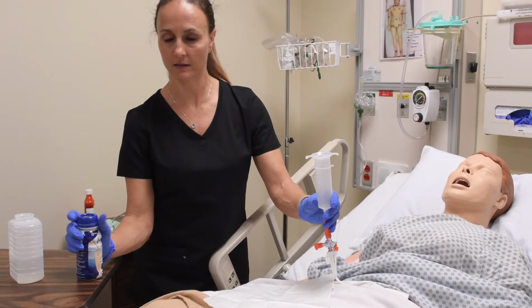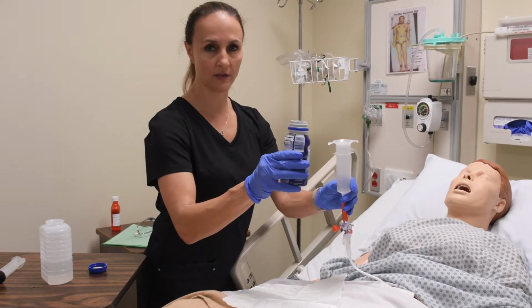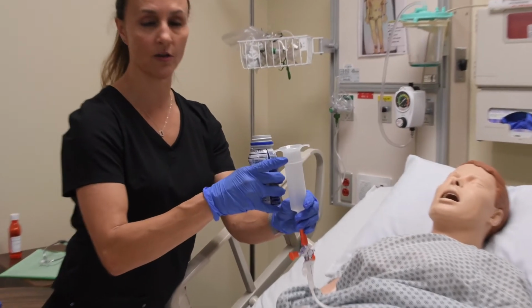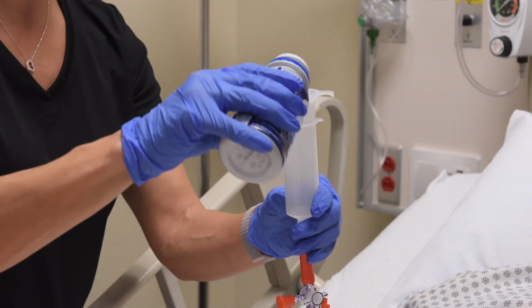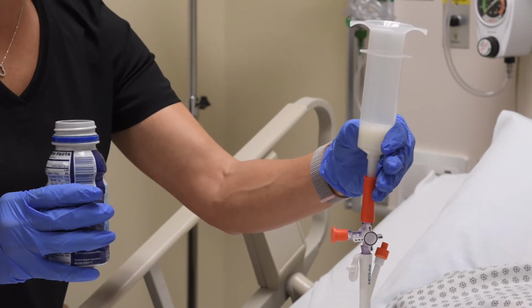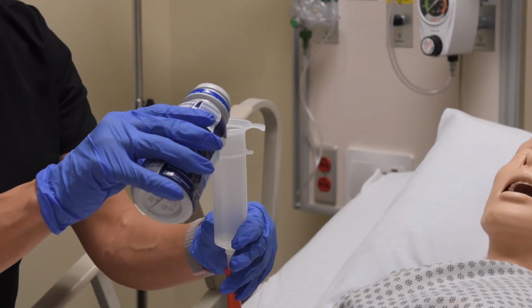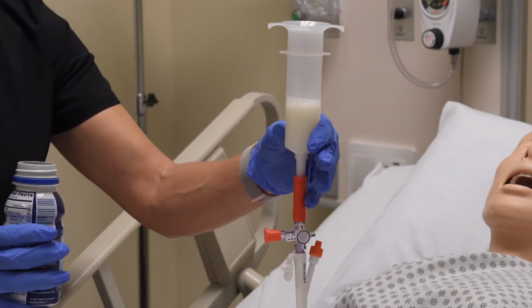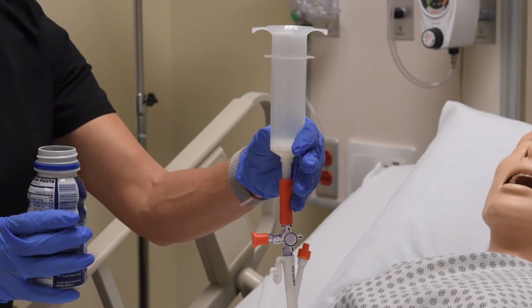I already have the lid to my can loosened. And by gravity, I want to go ahead and pour the feedings. Just pour a little bit at a time. Don't let it fill all the way up because if the patient does cough, sometimes the feedings can come out. Ms. Jones, I'm giving you your feedings. If you start to get any kind of fullness or nauseated or anything, just let me know. I'm going to continue to do this until all of the feedings has been administered.